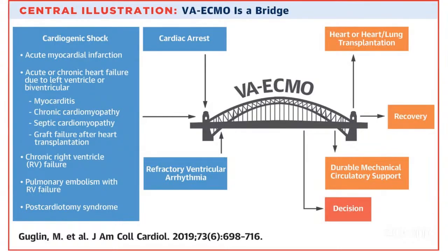In that scenario, once you give the ECMO support over a period of time, the myocarditis improves and the patient can improve. A patient who has come with acute myocardial infarction, whose reperfusion and revascularization have been done, can recover. So it can act as a bridge to recovery. Sometimes the patient may not recover, the LV function may not recover. In that scenario, it acts as a bridge to mechanical circulatory support.